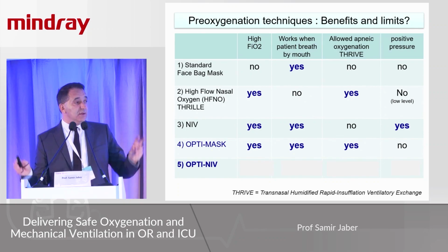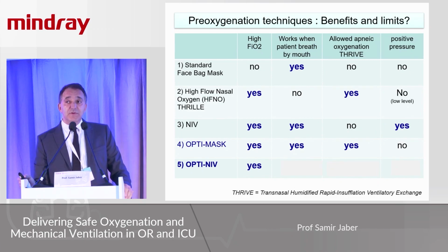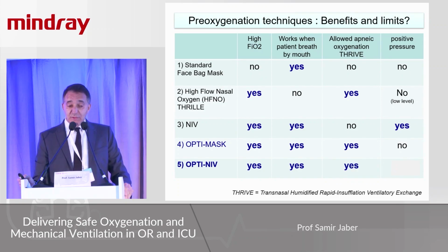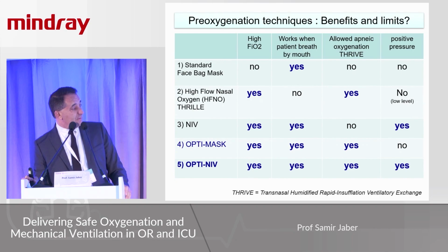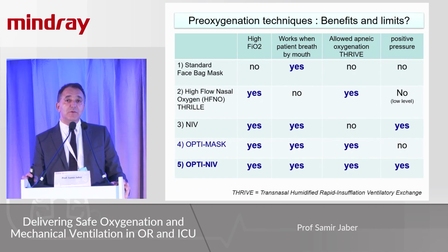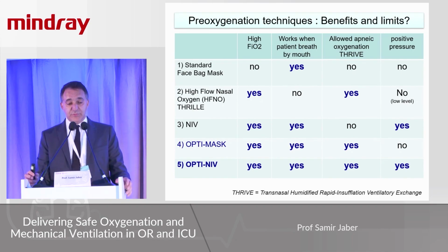And finally, what could be the gold standard is probably the OptiNIV technique, which can deliver higher FiO2, can work with open mouth, and you have apneic oxygenation with high flow, and you have positive pressure. This table can summarize the main works of different strategies and why we can associate two techniques and could be synergic.